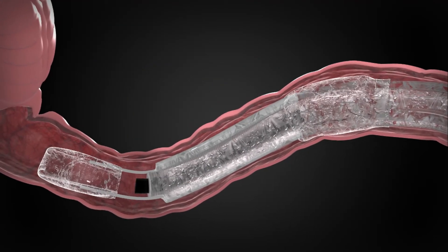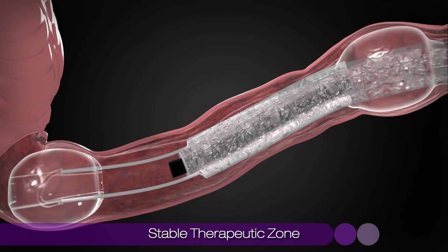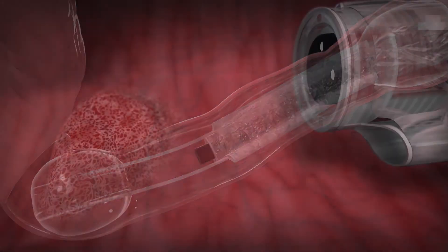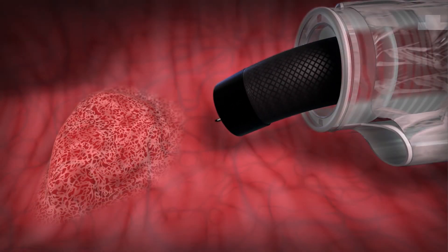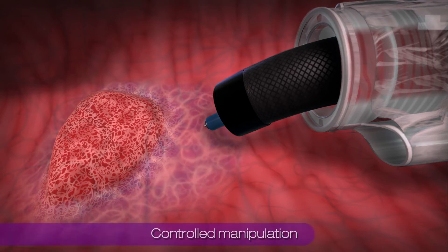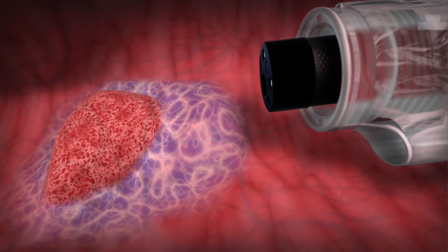In the treatment of complex polyps, the Dilumen C2 is positioned and the balloons are inflated to create a stable therapeutic zone. Standard submucosal injection is employed to lift the polyp. Dilumen instruments are then used to facilitate a controlled manipulation and dissection of mucosal and submucosal tissue.